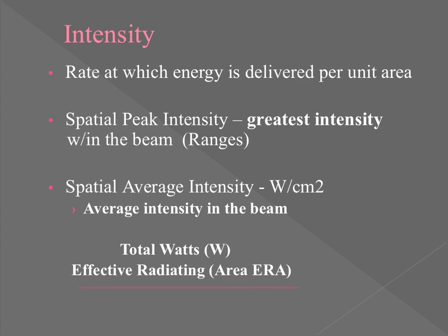Got it? Okay. Intensity. When we talk about intensity, it's the rate at which energy is delivered per unit area. It has nothing to do with depth of penetration. So I'll say that again. There are really two types of intensities that we have to think about. The first one is spatial peak intensity, which is the greatest intensity within the beam. Okay. Greatest intensity in the beam.